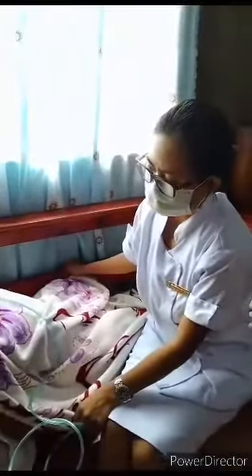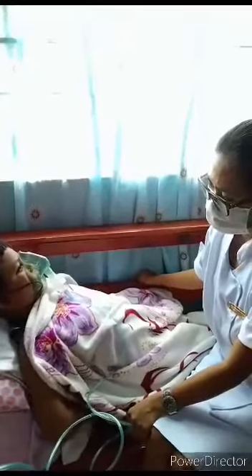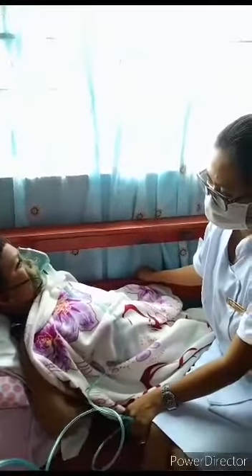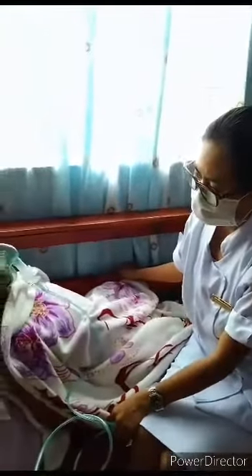Step number 11. Remain with the patient until all the solution has been nebulized. Instruct the client to continue the treatment until he or she can no longer see a mist on exhalation from the opposite end of the mouthpiece or vent holes in the mask. Lack of mist ensures that the client has inhaled the entire dose.